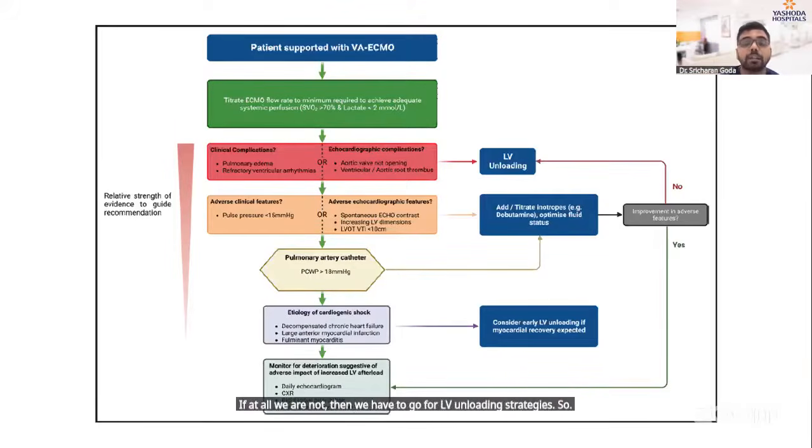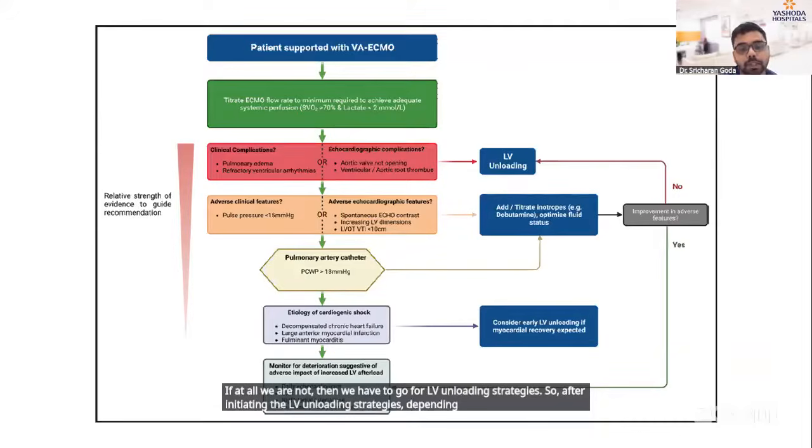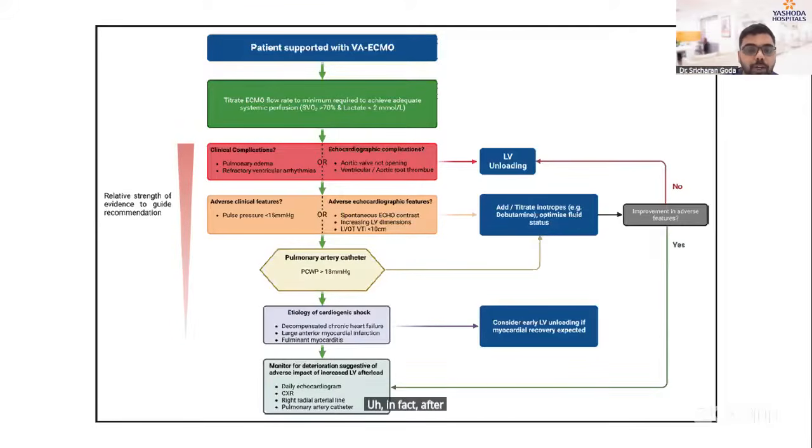After initiating the LV unloading strategies, depending upon our preferred method, after the recovery of the myocardium, we can look for de-escalation of the LV venting supports as well as the VA ECMO supports.